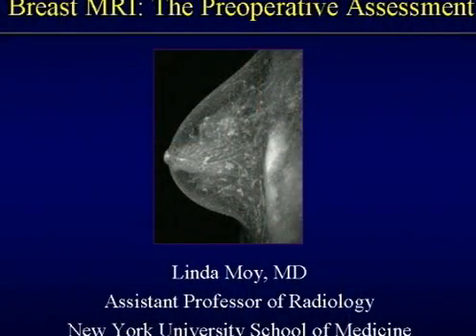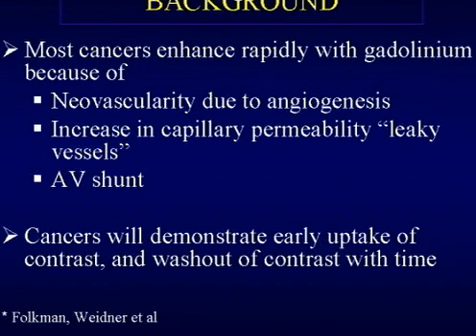Okay, now that we've had a general overview of the MR lexicon, this lecture is really going to focus on the role of MR in a patient who has just been diagnosed with breast cancer. As I mentioned before, now we'll go over the protocol for the 1.5. So basically a background slide.